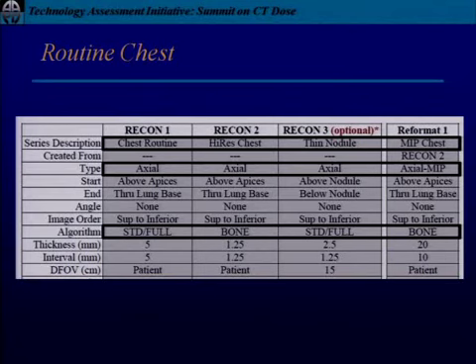I misspoke. This is the reconstruction algorithm. We use standard, and we write down full or plus, so that is clarified. And then slice width, image width. Diana, that's going to stick with me forever, which was your point. So we've got the image width, reconstruction, and what sort of reconstructed field of view, display field of view. So that would be our translation.